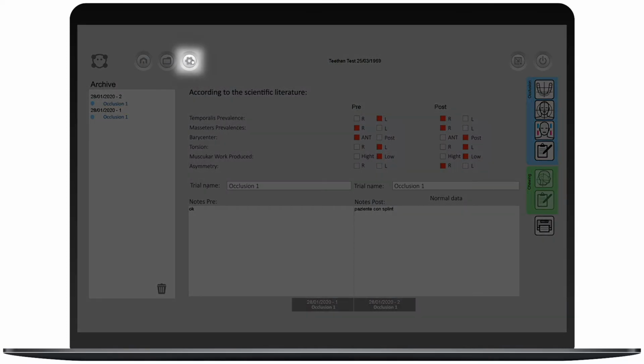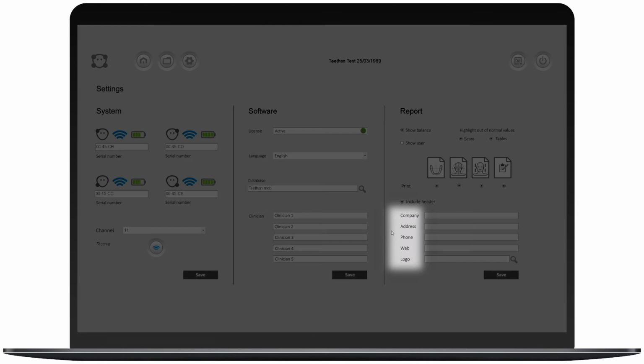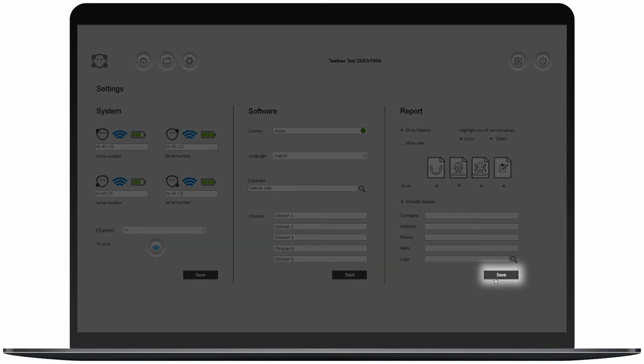In the Settings menu, it is possible to customize the report by deciding which data you want to be included. It is also possible to insert your clinic details and logo. By clicking on the Save button, these changes will be applied as your default settings.